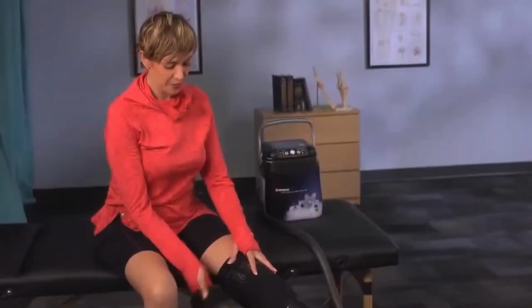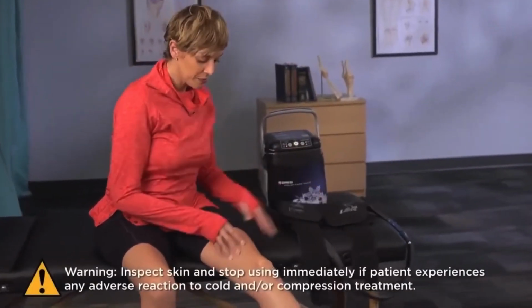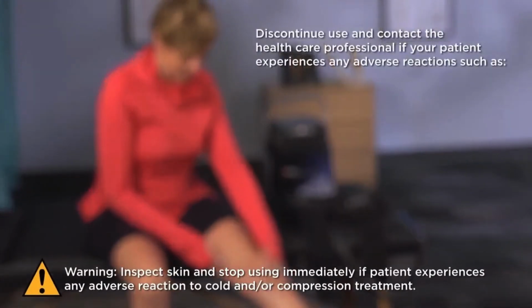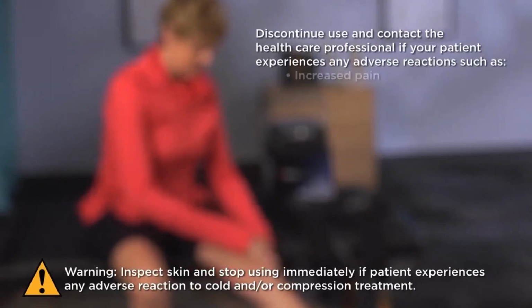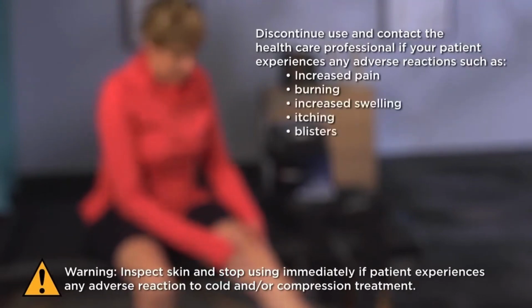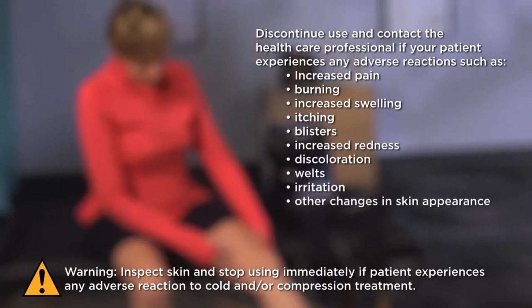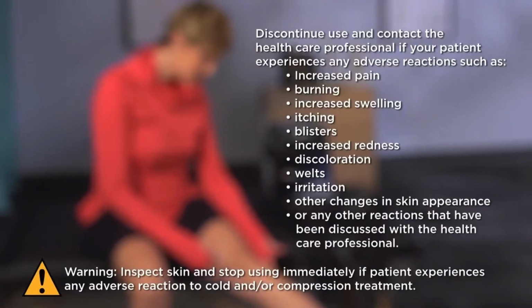Be sure to inspect the skin under the entire pad as prescribed by the healthcare professional, typically every 1 to 2 hours during use. Discontinue use and contact the physician if your patient experiences any adverse reactions such as increased pain, burning, increased swelling, itching, blisters, increased redness, discoloration, welts, irritation, other changes in skin appearance, or any other reactions that have been discussed with the healthcare professional.